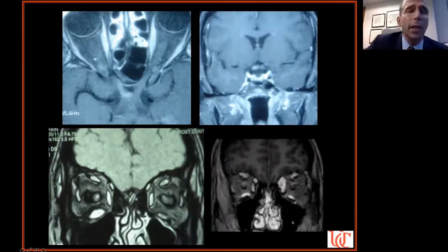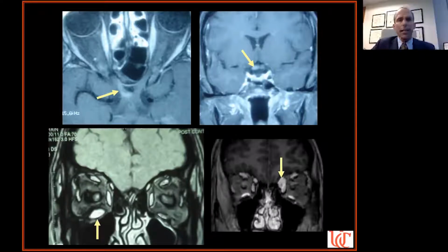I showed the patient the scan and he said, "What's that?" And I said, "Yeah, that's the normal scan." He was not happy. So that's another, all of these scans are reasons that you, the ophthalmologist, should be looking at your scans because you know exactly where you want to look.